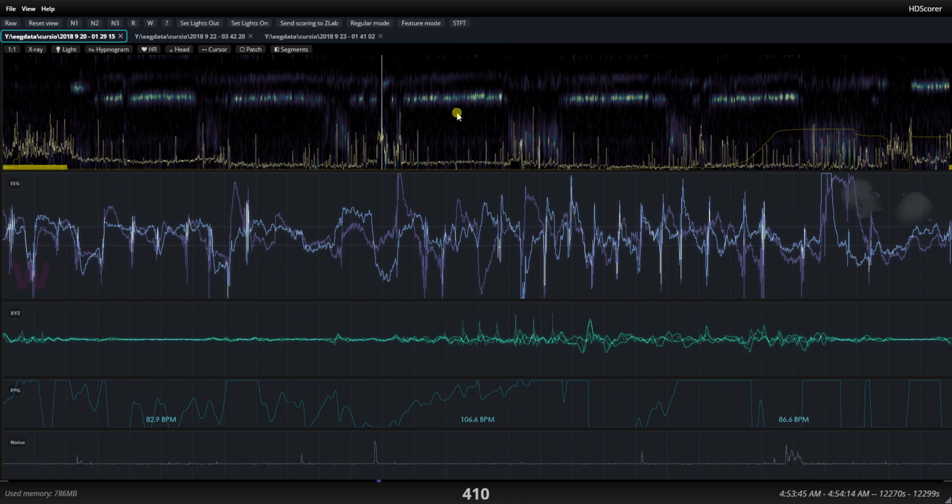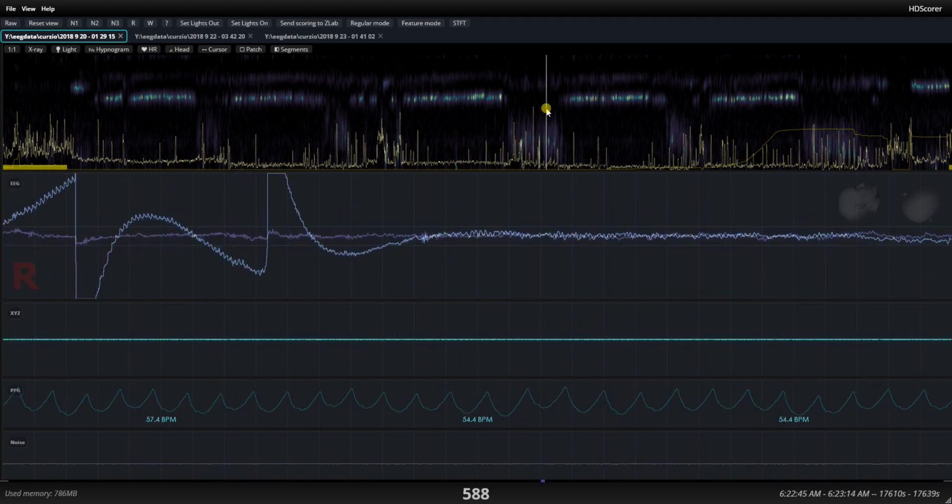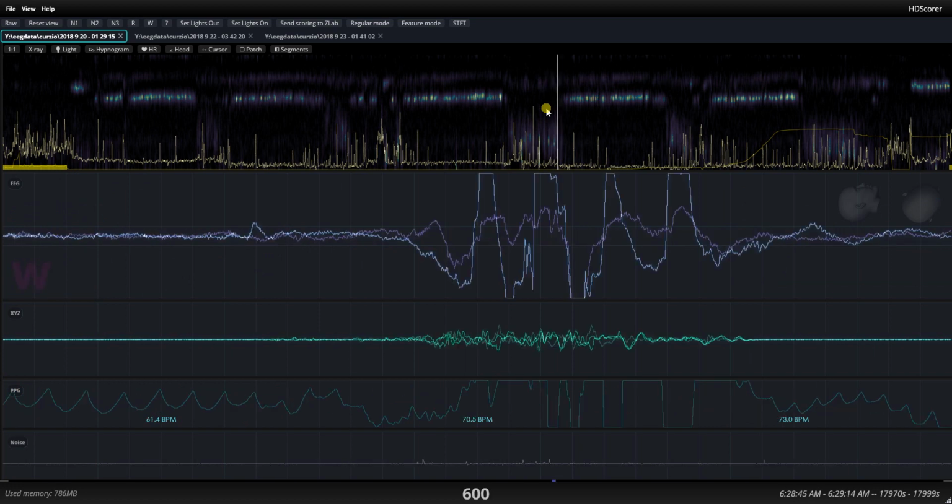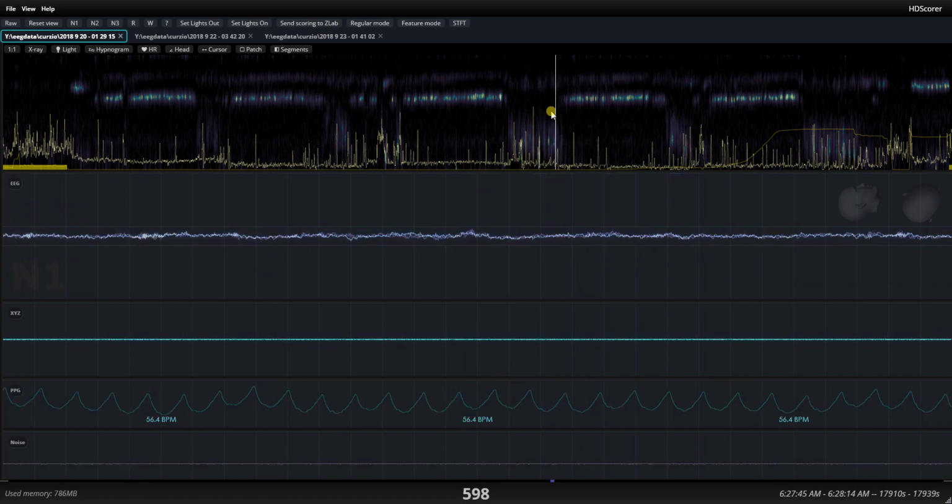But one thing that people say about these wristwatches that claim to stage your sleep is, at least they can see when you're in REM phase because you've got higher heart rate, or more heart rate variability. Let me tell you something. The only reason you have higher heart rate variability in REM is you have more moving around. And so yeah, these peaks here, you see a lot of peaks right here. You see a few peaks right here, but still happening a lot. They're the reason why you see so much heart rate variability to a large extent.